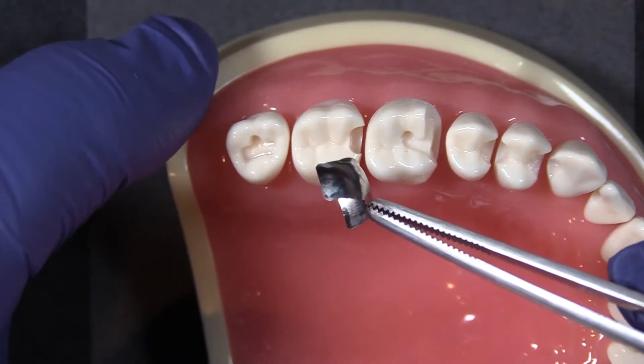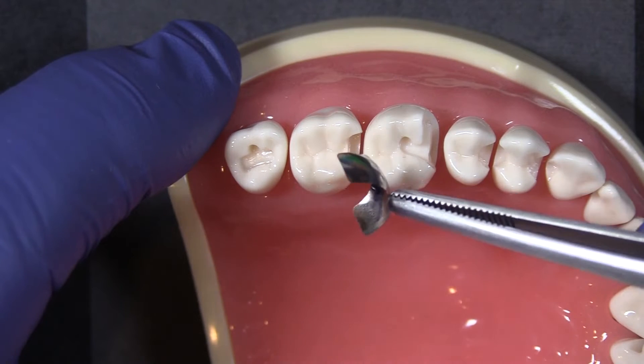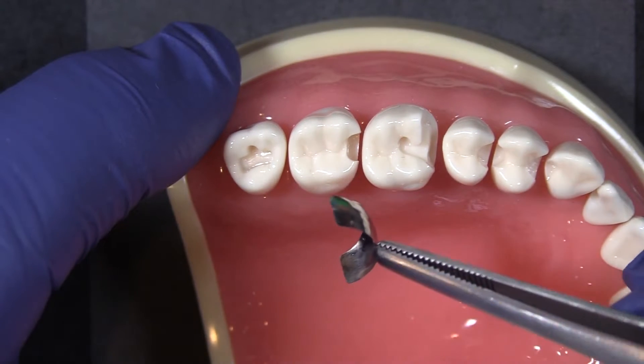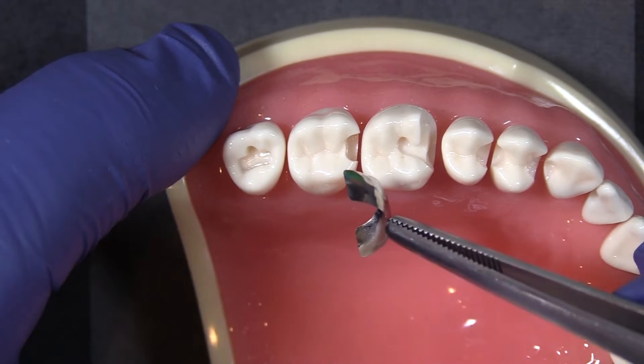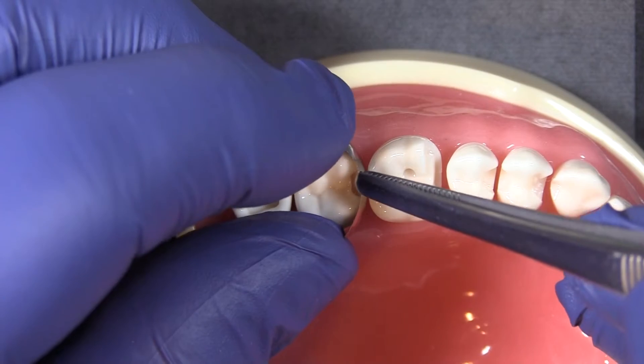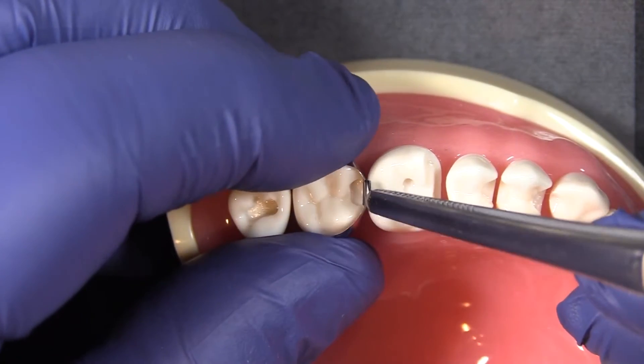Today we're going to take a look at doing this MO on tooth number two. I've already selected a band that closely approximates the height of the tooth — you don't want one that's too tall or too short. Grip it by the placement tab and use just a little rocking motion to roll it around the infra-bulge of the tooth so that it doesn't get caught on any of the edges of the prep.